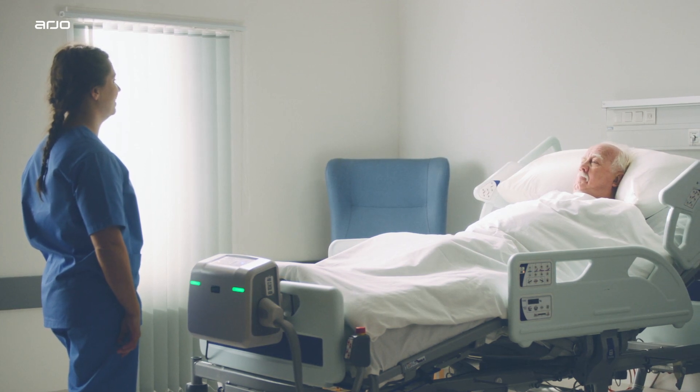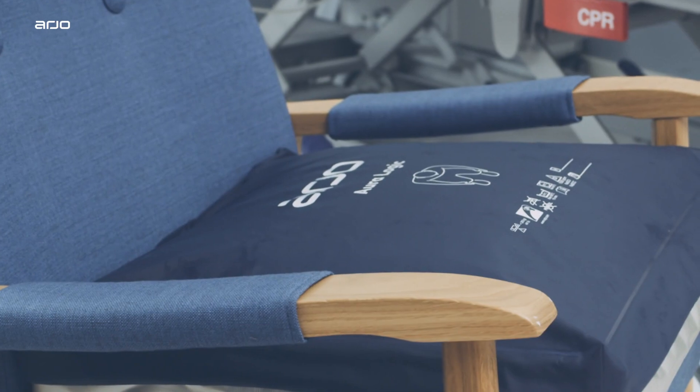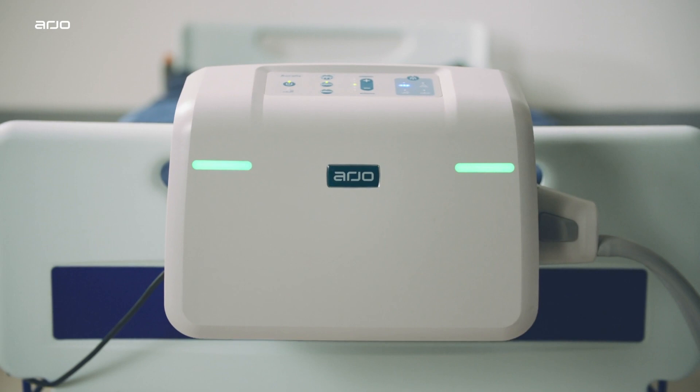The complete Oralis range includes a mattress replacement, mattress overlay, seat cushion and bariatric mattress replacement, all of which can be operated from the Oralis pump.